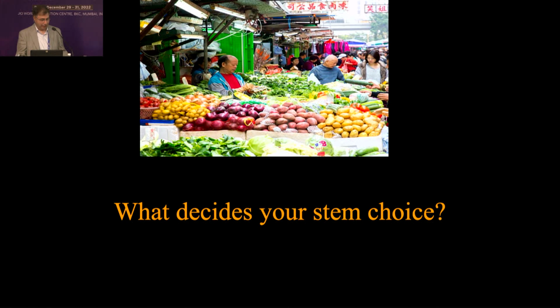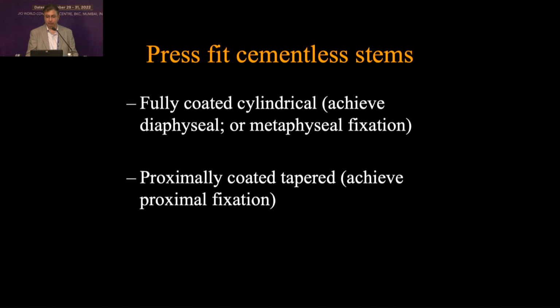Now, I'm sure having looked at this conference for the last 2 days, you realize what choosing a hip replacement is all about, right? You've seen the number of vendors upstairs, and it strikes me that almost everybody here manufactures hip replacements. By and large, if you put your hand on your heart, I'm sure you realize that you decide your stem primarily based on the relationship with your vendor, the comfort of doing the hip replacement, and finally, on the longevity of the hip replacement itself.